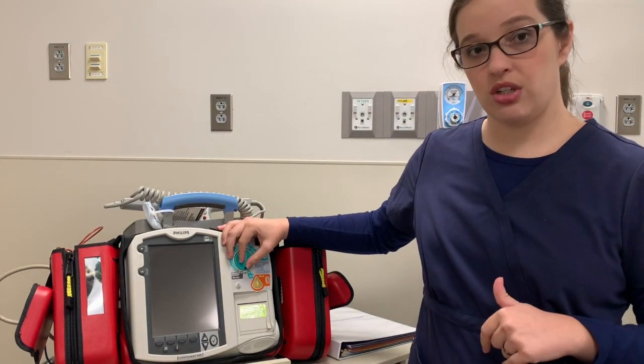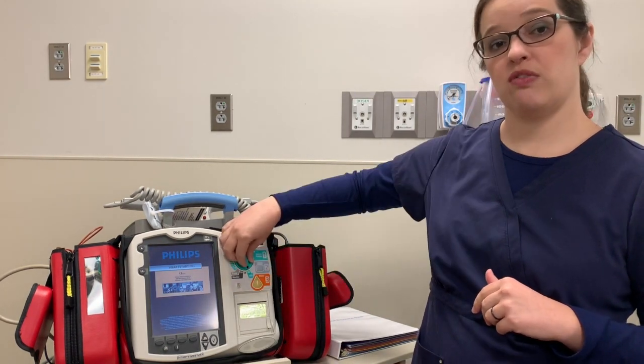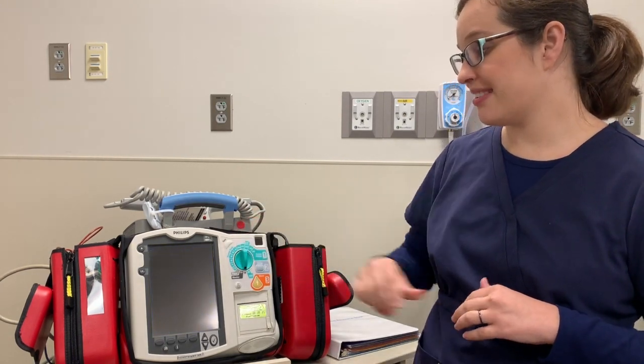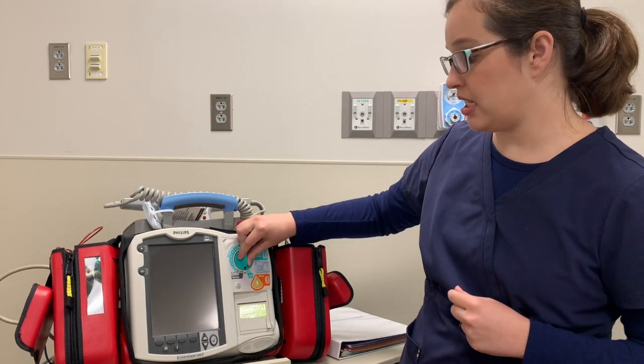To turn on your defibrillator, you have a couple of different settings and options. One of them is the AED option over to the left. We don't use this in the hospital setting because it will only recommend defibrillation for a V-fib rhythm. If you have a VTAC without a pulse, the monitor doesn't know that you don't have a pulse, so it won't recommend defibrillation. We want you to interpret your rhythms on your own because you understand the whole clinical situation. So we don't use AED in the clinical setting.